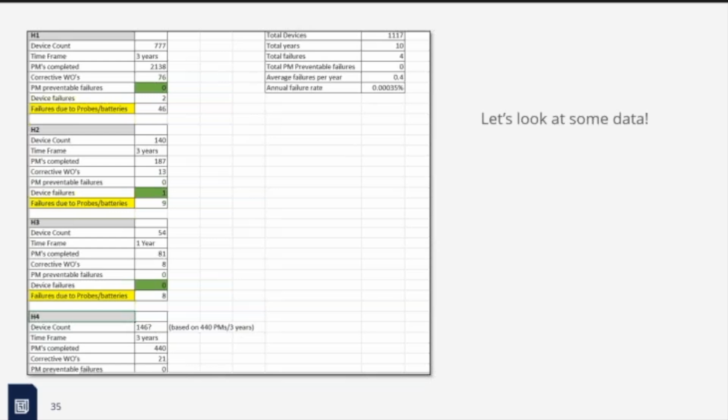Yeah, it's actually the percentage of failures is more on hospital 2 if you look at the 1 failure. But the roll-up part is where, like I said, we summarize all that. The same device type across multiple hospitals is where we get the total number of failures, which was 4. I think the screenshot cut off the bottom of this one when we were cropping it, so we don't have the numbers. They're trying to figure out why there's 4 failures.